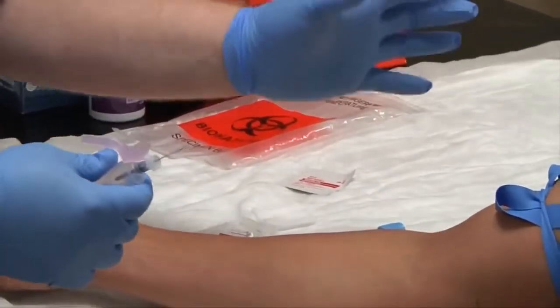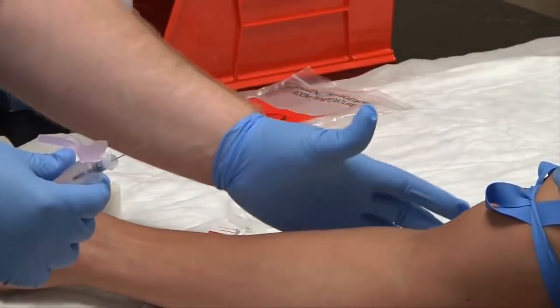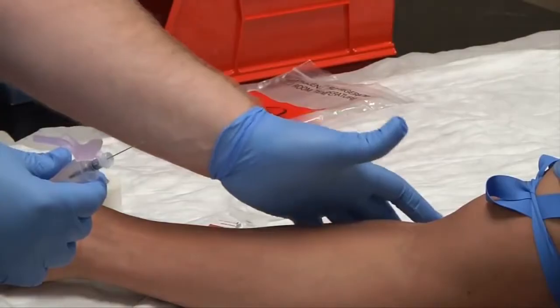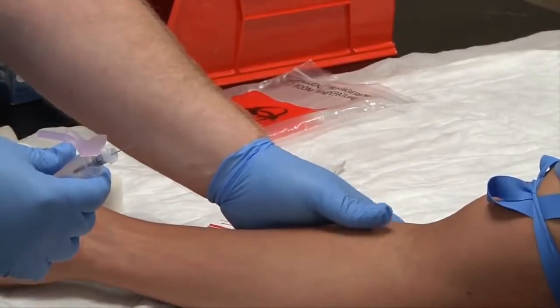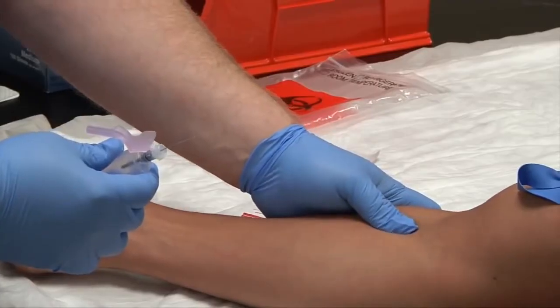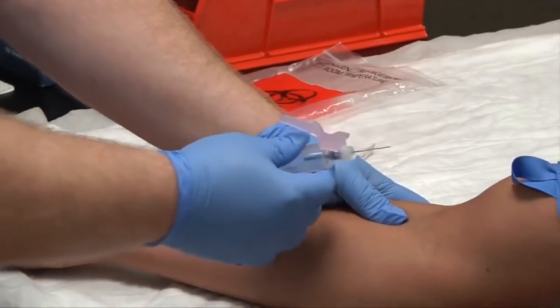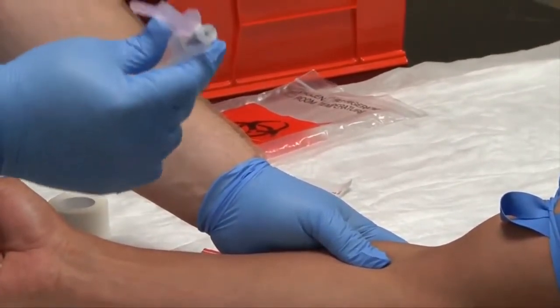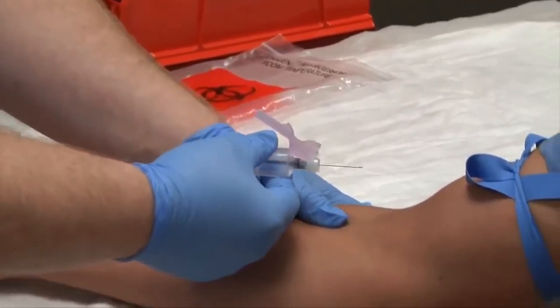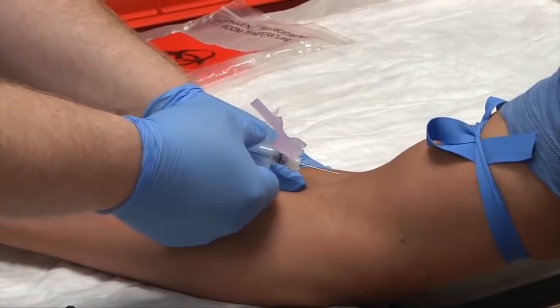Okay, with my non-dominant hand, I'm going to anchor with my thumb. My other four fingers are going to wrap around the patient's arm. What you'll do is you push down and pull back a little bit, and that anchors your patient's vein a little bit. With my dominant hand, that's the one I will stick with. All right, here I go.